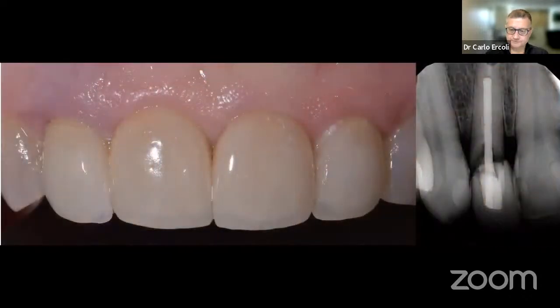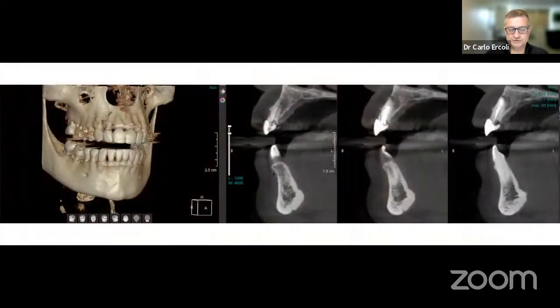Again, other cases, tooth number 12, where you can see, of course, that there is a cavity, there is a significant problem on this tooth that will have to be extracted. But at the same time, what you see both on the reformatted CT and on the cross section is that there is also a periapical radiolucency right here that you can picture also in this area right there. So we know that we have a fenestration in the buccal bone in that area.